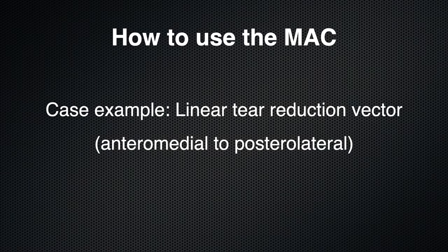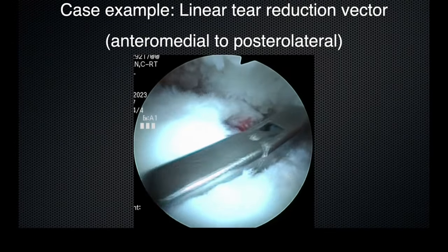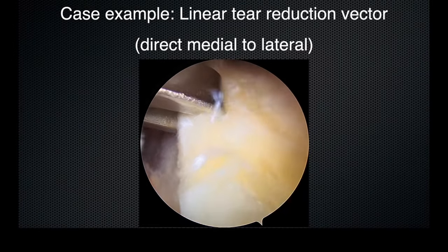Here is an example of a tear that reduces from the anteromedial to posterolateral direction. Here is an example of a rare tear that reduces from the direct medial to lateral direction.